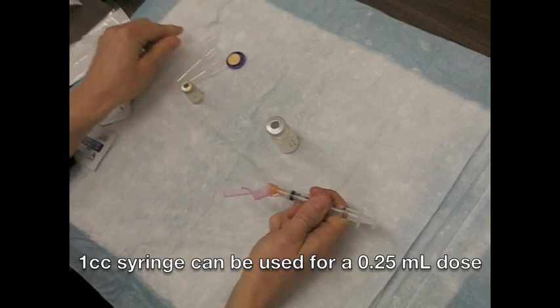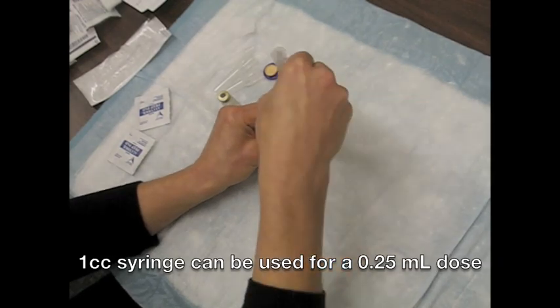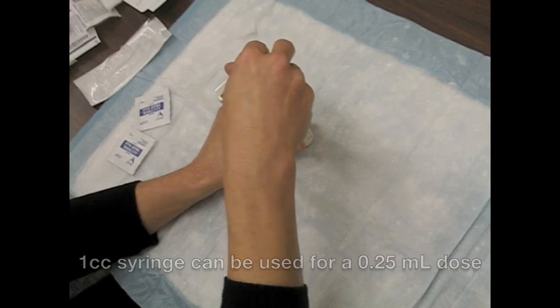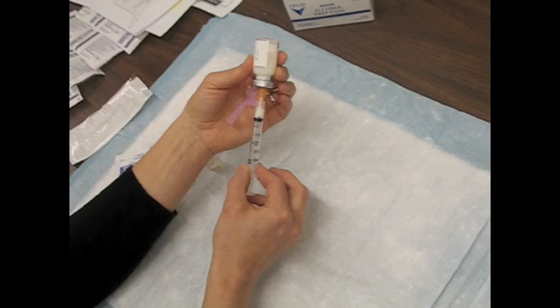The prepared vaccine requires a 1 inch needle with a 3cc syringe. The volume of Arapanrix H1N1 vaccine after mixing equals 10 doses of 0.5 milliliters. For children under 10 years old, the dose is 0.25 milliliters.